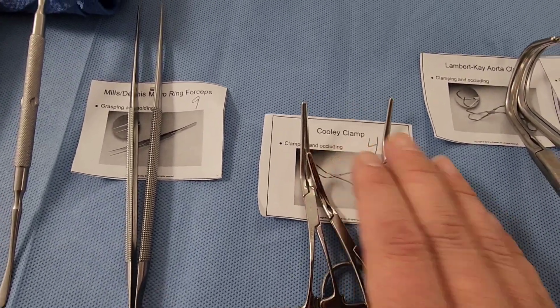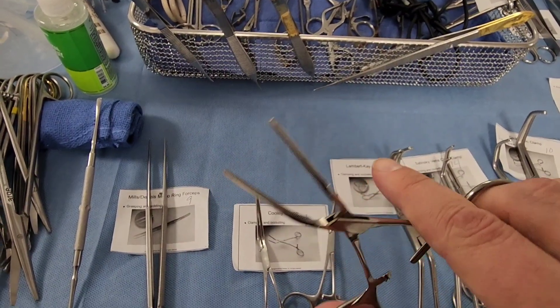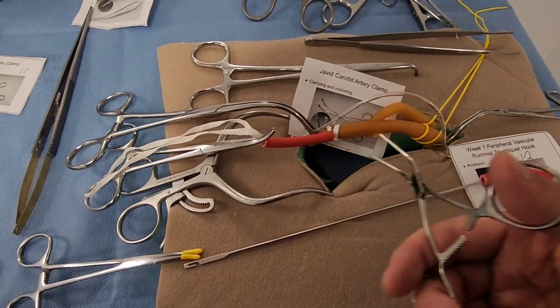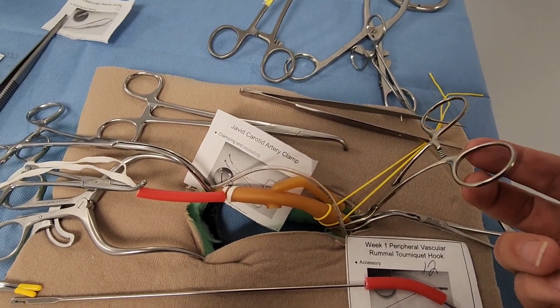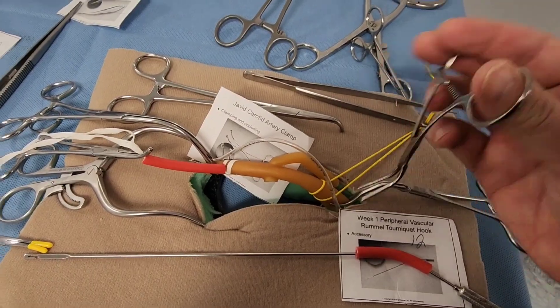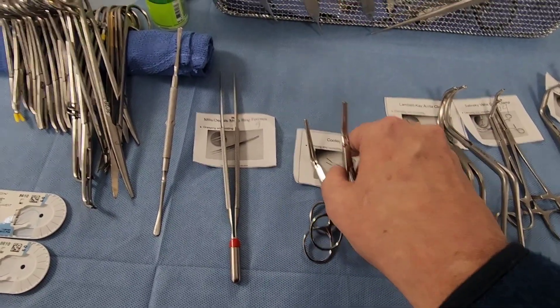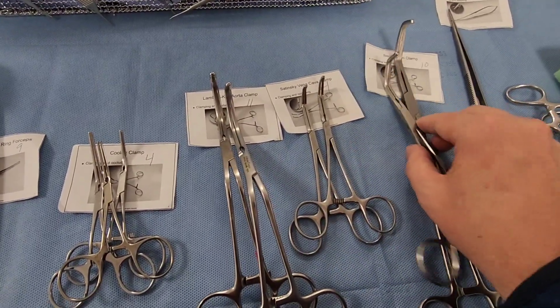The Cooley clamp — you can see it's angled and comes in a larger size with a non-traumatic, DeBakey-style serration. It's designed to come in at an angle to clamp off a vessel without being in the way of the operative field. The Cooley clamp is one of the most common clamps you'll use, maybe right behind the profunda.